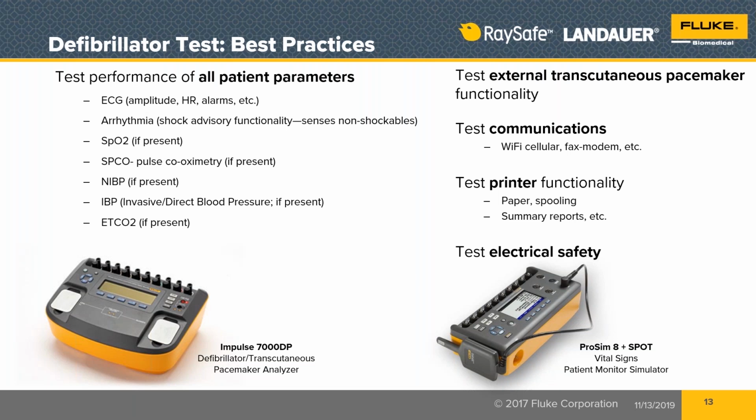We also do the synchronized cardioversion test, and we do a series of output energy tests. For routine testing, like twice a year, normally we would just test with the 50 ohm load. And then, as I said, for acceptance testing or post-repair or this clinical problem, then we do the extra load testing, unless the manufacturer requires those extra loads.